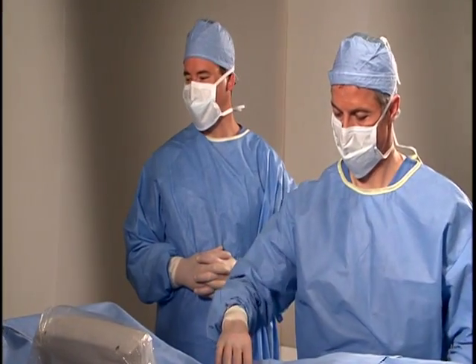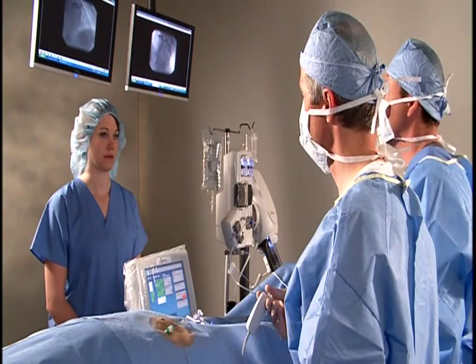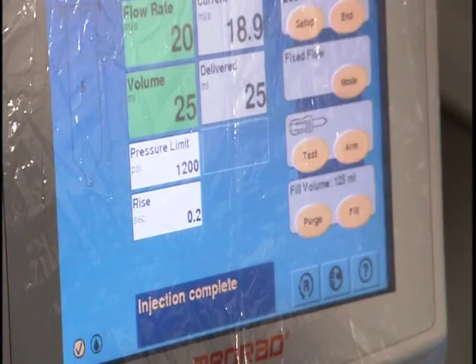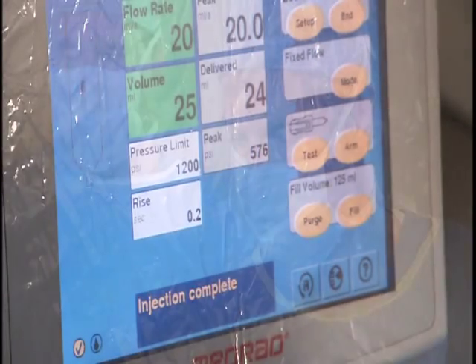When the refill alert is set and the syringe goes below the user-set threshold, an audible alert of 5 beeps will sound, and the syringe will blink 5 times.